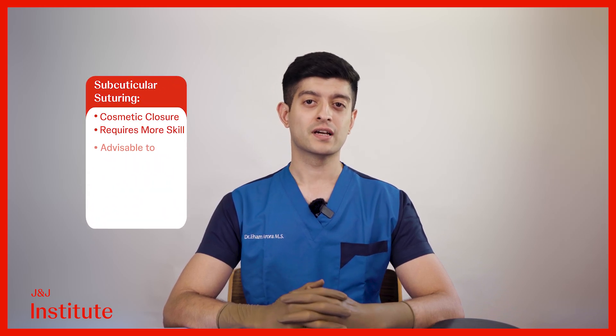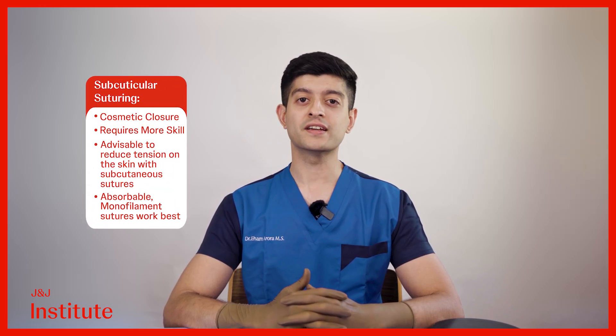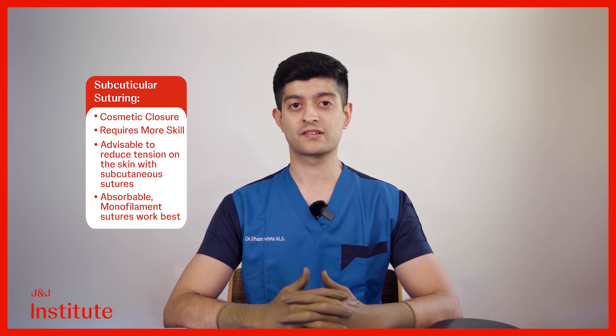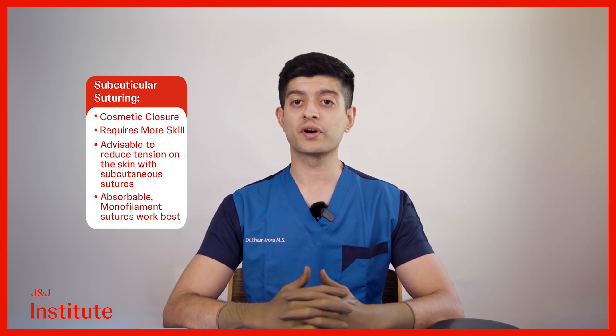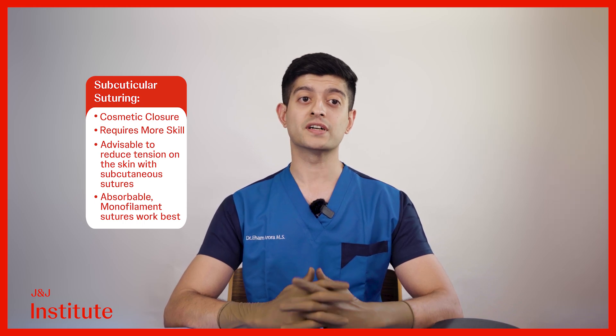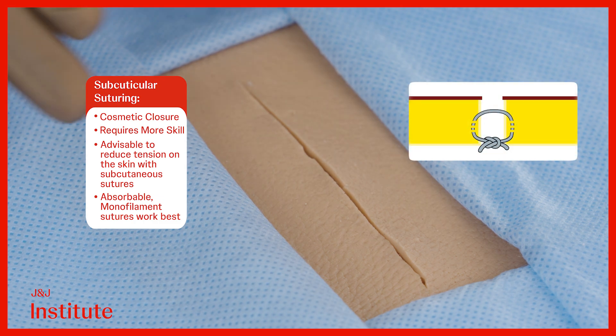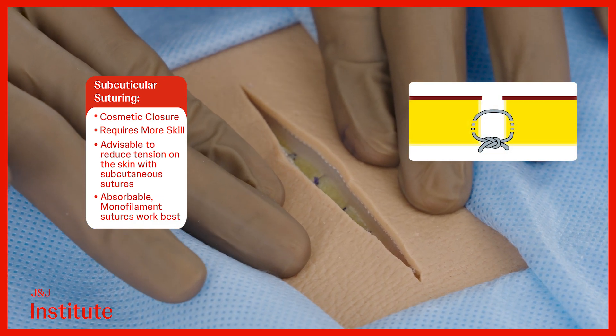Subcuticular stitches present a superior alternative to traditional suturing methods as they prevent any visible stitch marks on the skin. However, mastering the technique requires more skill compared to conventional closure methods. It's advisable to employ subcuticular stitches in cases without tension, or after addressing tension by initially placing deeper subcutaneous stitches, as we have done here.